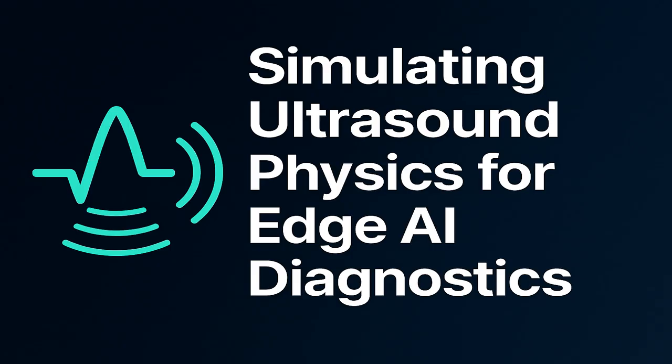Doppler fundamentally relies on the Doppler shift, which we call f_d. When our sound wave reflects off of moving scatterers, like red blood cells, the frequency of the returning echo is shifted. And that shift is proportional to the velocity, v, of those scatterers relative to the probe. The resulting velocity equation, v = (f_d · c) / (2 f_0 cos θ), contains a really critical term that causes the most diagnostic headaches, which is the beam flow angle, cos θ. Oh, that angle dependence is the Achilles heel of quantitative Doppler.